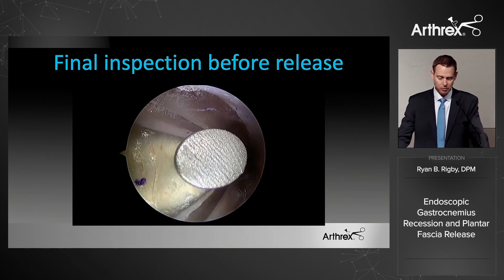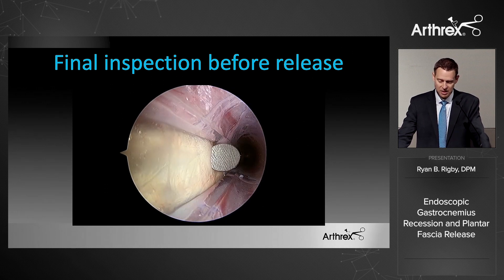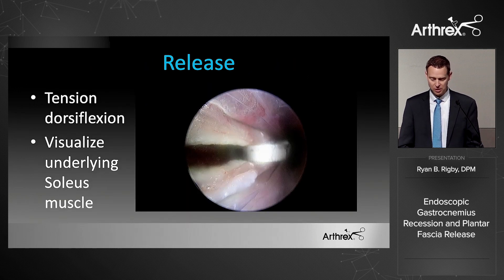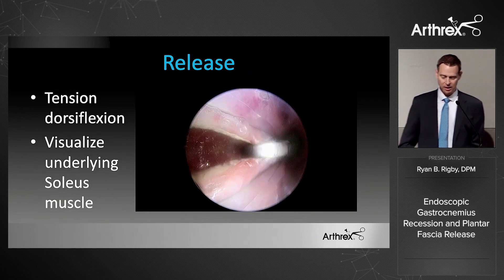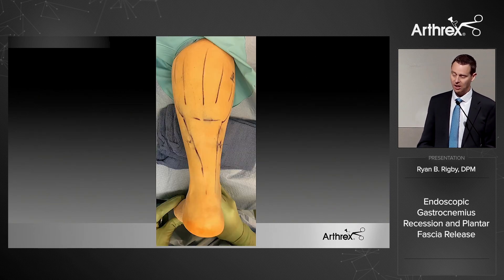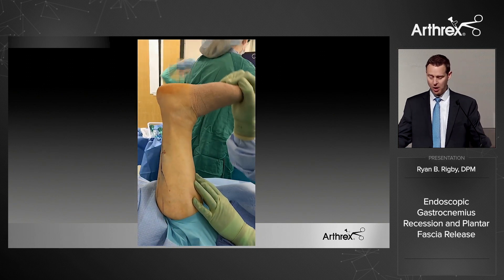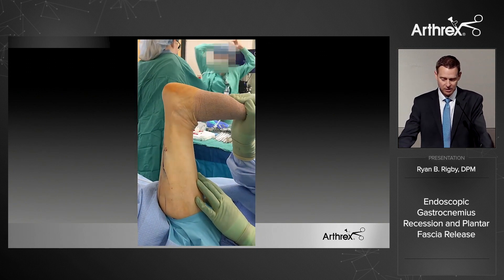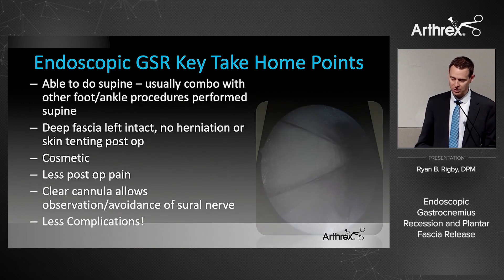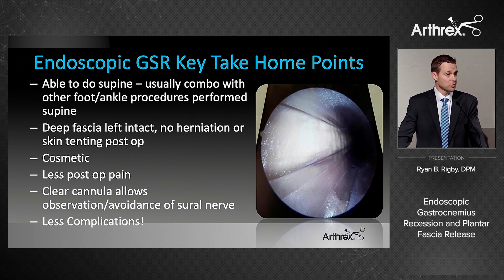Do a final inspection before releasing — run the dissector tool along the fibers to confirm you're safe. Then do a sharp release with gentle dorsiflexion; you should see the underlying soleus muscle belly. You can do a half or full release and get a nice recession. A couple of stitches and you're done. At first it took a little time to adjust, but now it's very fast and I'm very happy I made the switch.